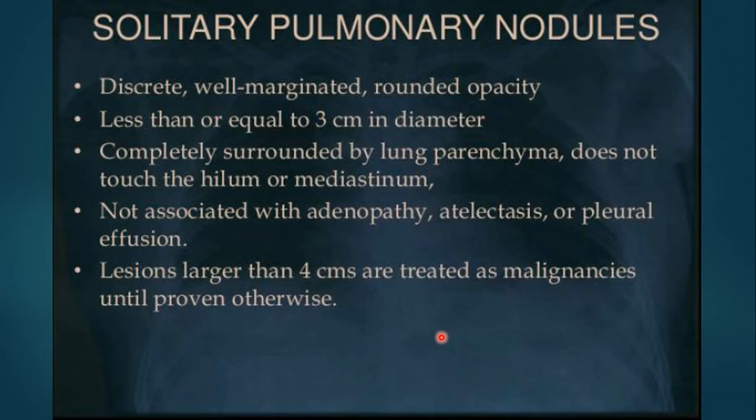It should be completely surrounded by lung parenchyma. The surrounding tissues are all lung parenchyma, aerated lung. It does not touch the hilum, does not touch the mediastinum. Not associated with adenopathy, atelectasis, or a pleural effusion. Okay? If it is more than 4 centimeters, they are treated as malignancies until proven otherwise, until there is a biopsy that says something else. But it should be considered a malignancy, and biopsy should be done to confirm.